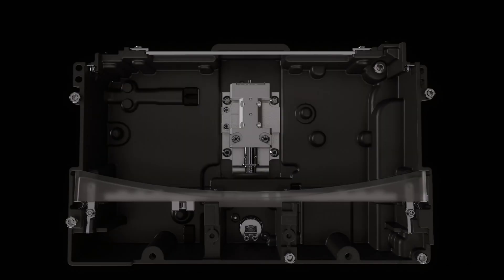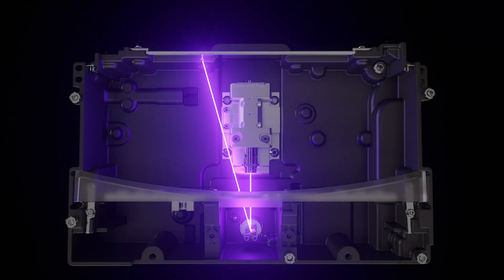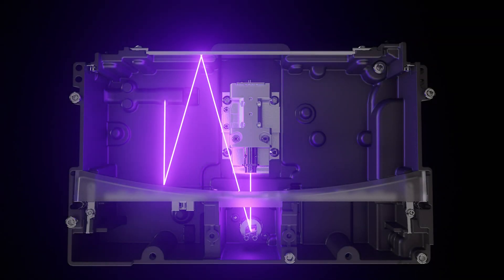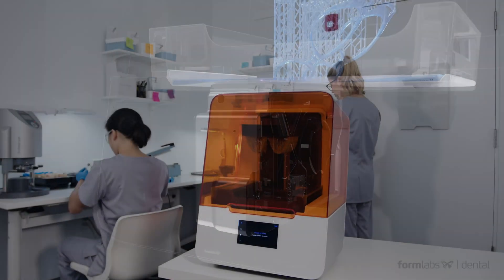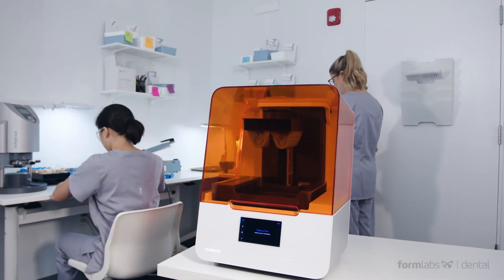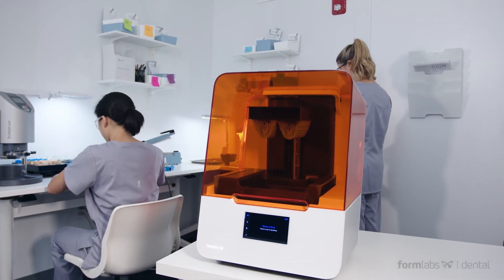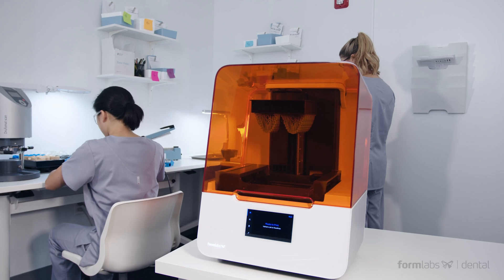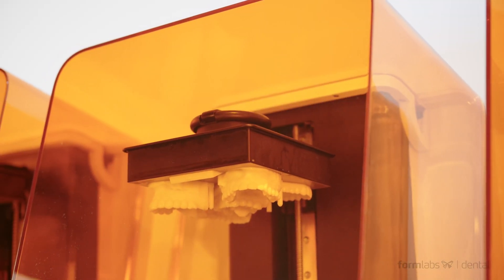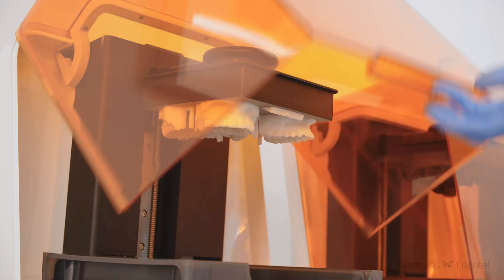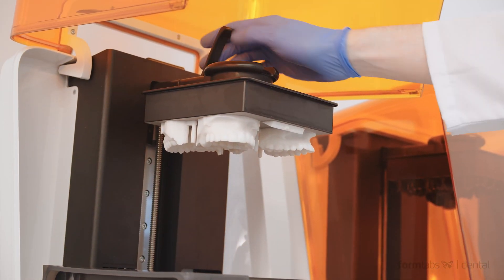A suite of new technologies like our proprietary low-force stereolithography and the new self-contained optics engine help the Form 3B take digital fabrication to the next level, allowing ortho practices to save time and costs by printing large batches of models all at once.